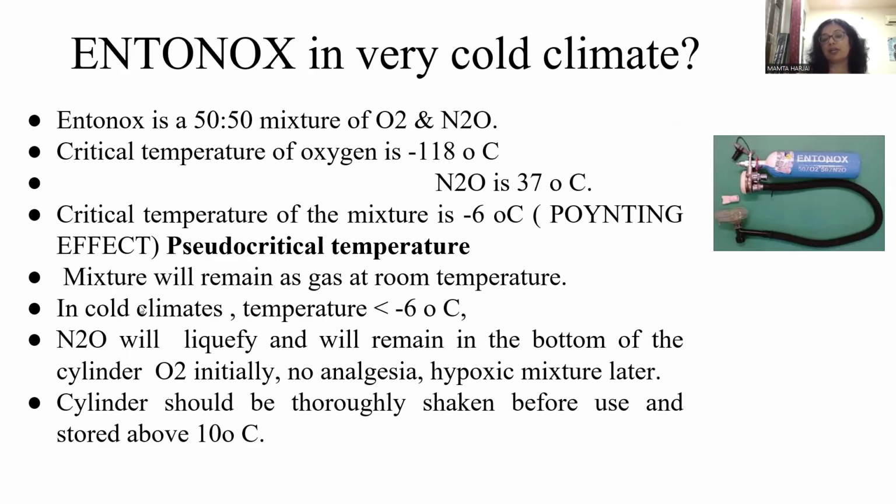Above the pseudo-critical temperature, both of them will remain as gases, but below the pseudo-critical temperature, especially in cold climates, what will happen? They will start separating into their individual components, and nitrous will start liquefying. So if the temperature is below minus 6 degrees, the nitrous will liquefy and remain at the bottom of the cylinder. Now, oxygen being in the gaseous state will be taken up by the patient. There will be no analgesia, but it will be taken up rapidly. Now, what is left is nitrous. So the patient will take up a hypoxic mixture, and that is really, really dangerous.